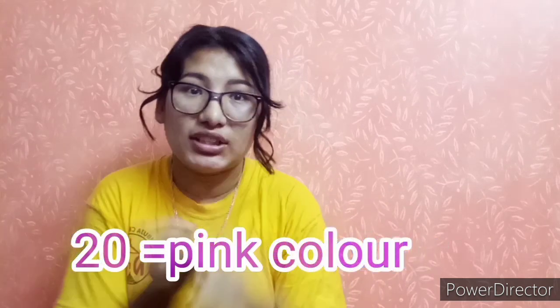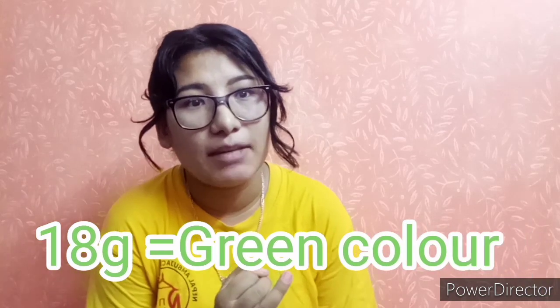This is a very important topic: IV cannula insertion. I am inserting into a peripheral vein. Different sizes are available. 22 gauge is blue color, 20 gauge is pink color, 18 gauge is used for blood transfusion, and 20 gauge is used most of the time. 20 gauge can also be used for blood transfusion.